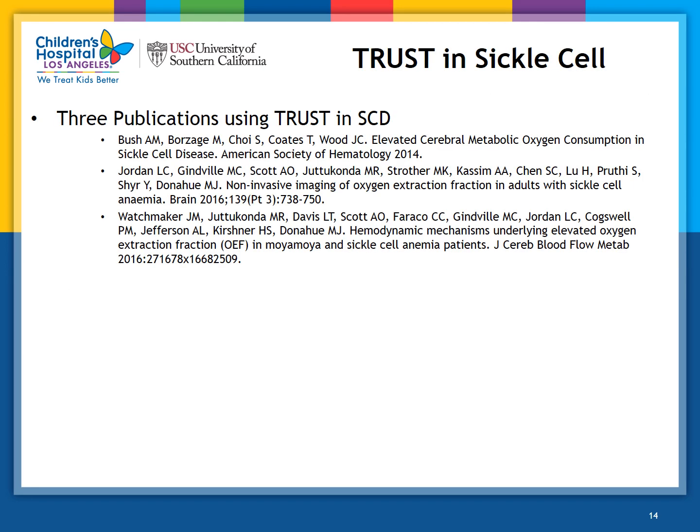Though TRUST is a recently developed technique, this work is not the first to use TRUST in sickle cell disease patients, as there have been several publications. Fortunately, the findings from all these studies are largely the same, with each reporting that oxygen saturation values are lower and oxygen extraction and metabolism are elevated in subjects with sickle cell disease. The thought being that subjects with sickle cell disease are tapping into oxygen extraction reserves, possibly reflecting stroke risk similar to phenotypes observed in carotid stenosis.